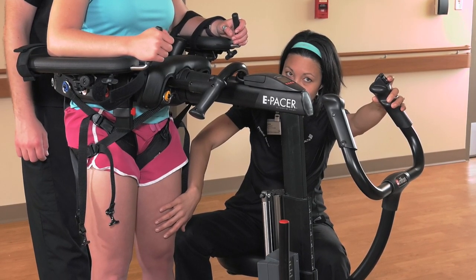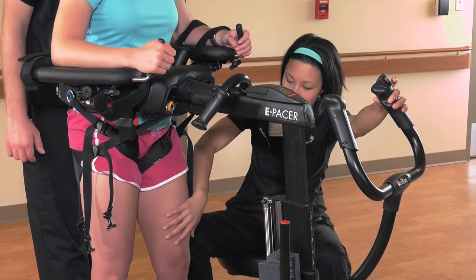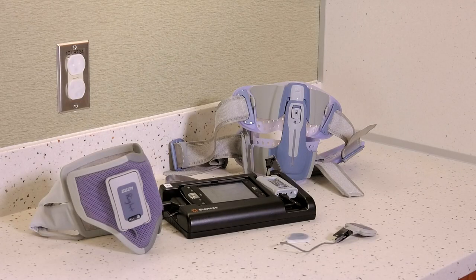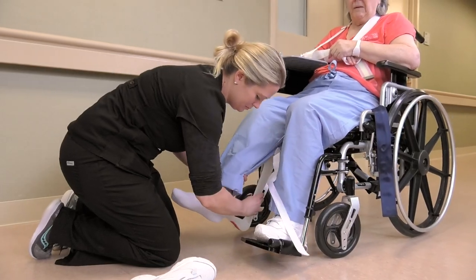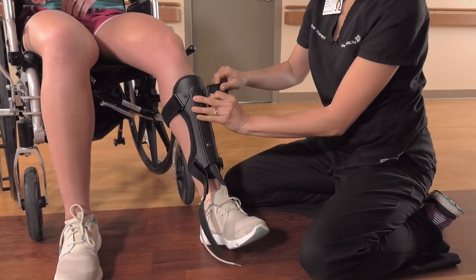The amount of support from the E-pacer itself can also be reduced as tolerated by lowering the body support slightly. Consider using e-stim to the quadriceps to facilitate knee extension or using an AFO to prevent knee buckling. Either of these treatment options works well in combination with the E-pacer.